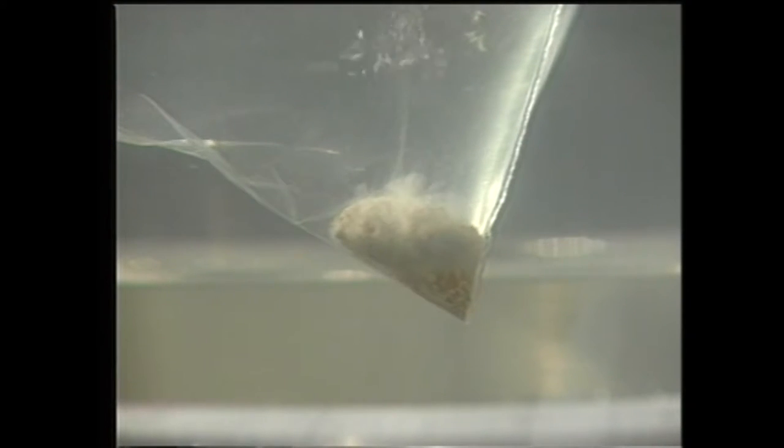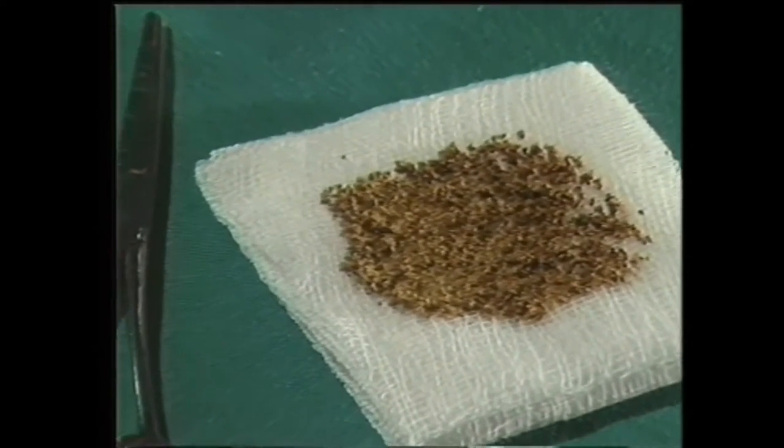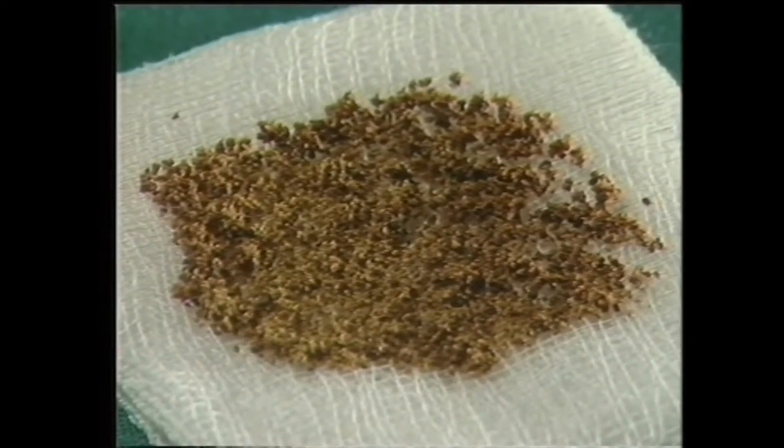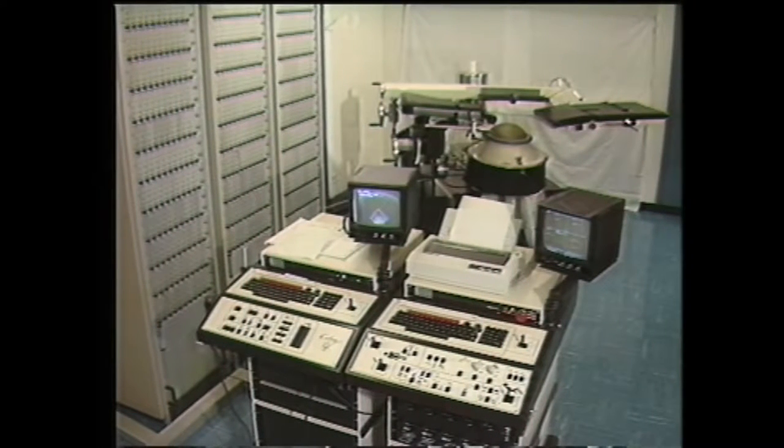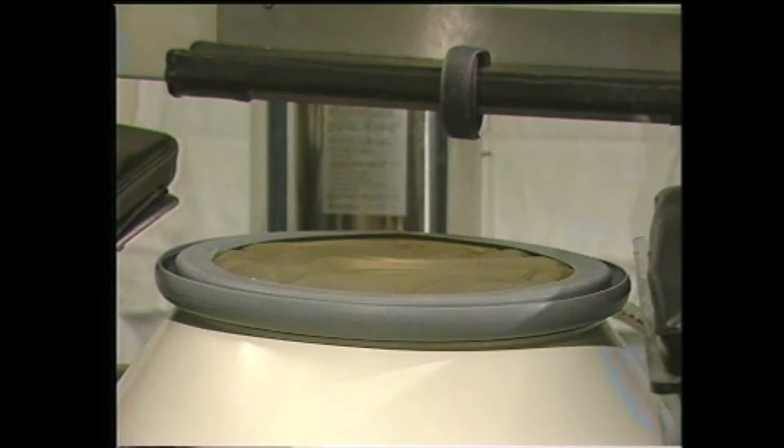En agissant par érosion plutôt que par explosion, ces ondes permettent d'obtenir une fragmentation progressive de la pierre en sable fin. Le lithotriteur EDAP est composé de trois éléments principaux : les consoles de commande, les armoires électroniques et la table sur laquelle le patient est installé.